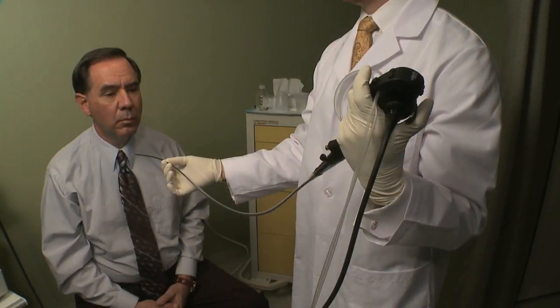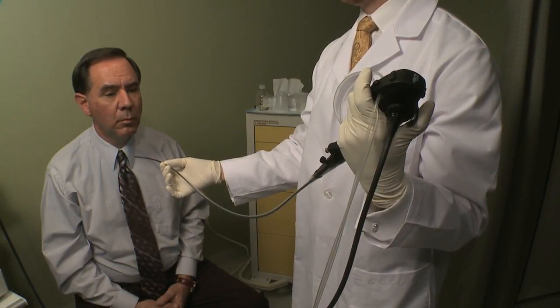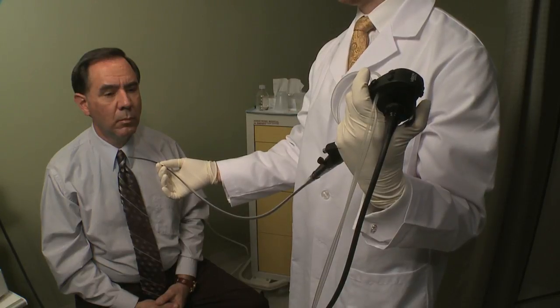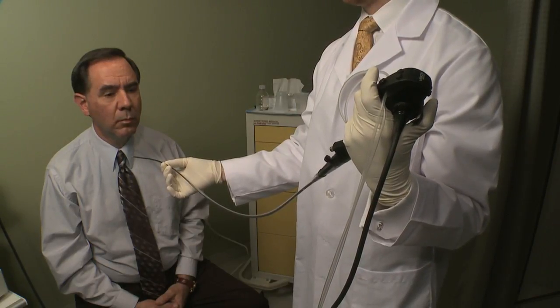The physician will typically stand with the monitor to the left and the patient to the right. The endoscope is typically held in the left hand to assure easy access to the biopsy port and simplified positioning for the physician.